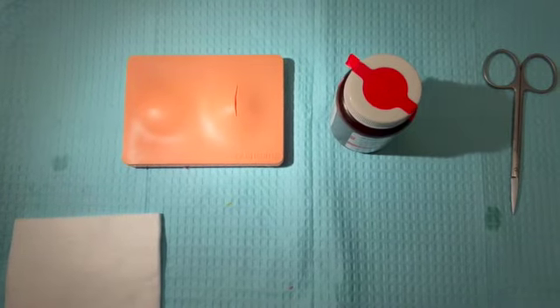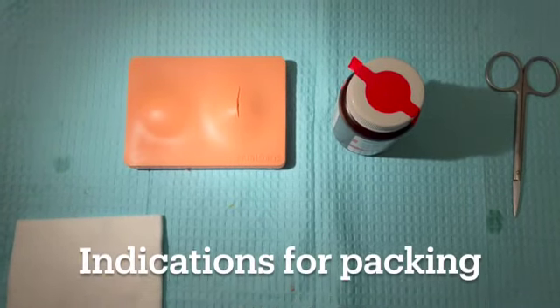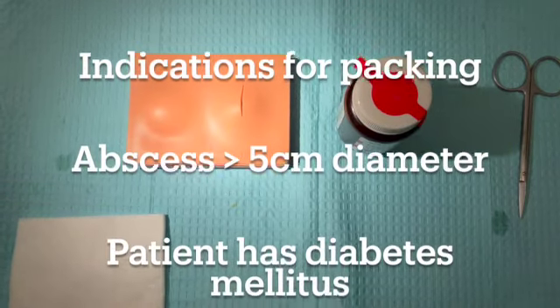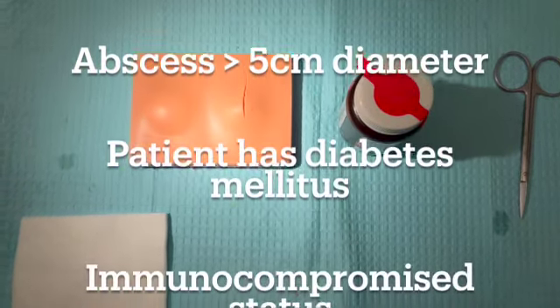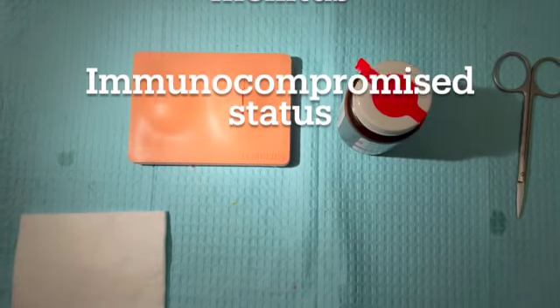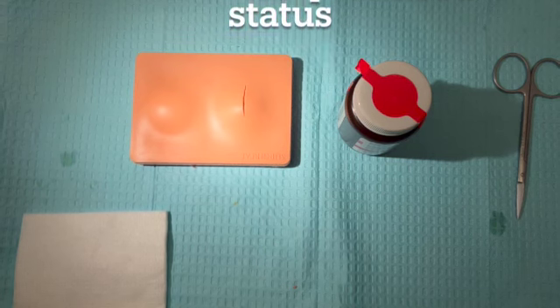Now we'll shift to the next portion of this procedure. I'm going to go ahead and place a packing. Indications for packing include if this is a very large abscess, typically greater than 5 centimeters in diameter, or if the patient has comorbidities. For instance, if our patient is diabetic or immunocompromised, we'll go ahead and place the packing material with a sterile packing gauze or iodoform.